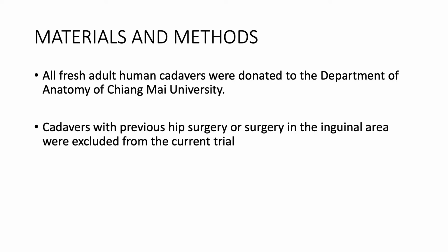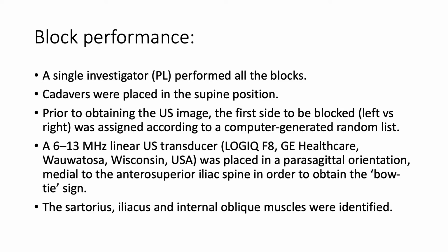So going into materials and methods, they used all fresh adult human cadavers which were donated to the Department of Anatomy of Chiang Mai University. So cadavers with previous hip surgery or surgery in the inguinal area were excluded from the current trial. Regarding block performance, there was a single investigator who performed all the blocks. Cadavers were placed in the supine position.